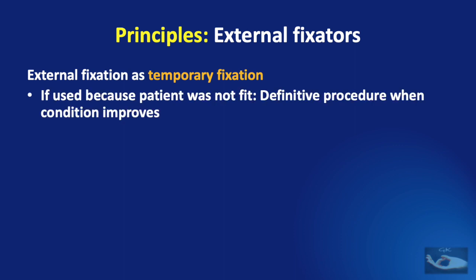The external fixation that we have done can be used as a temporary fixation in some situations. If it was used because the patient was not fit for the internal fixation procedure, the definitive procedure can be done when the condition improves and the external fixator can be removed.